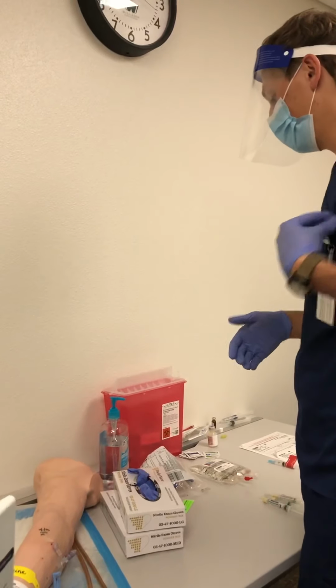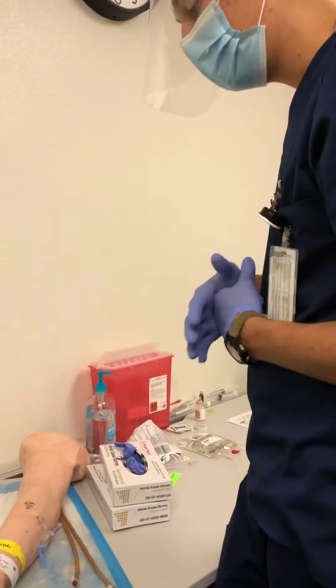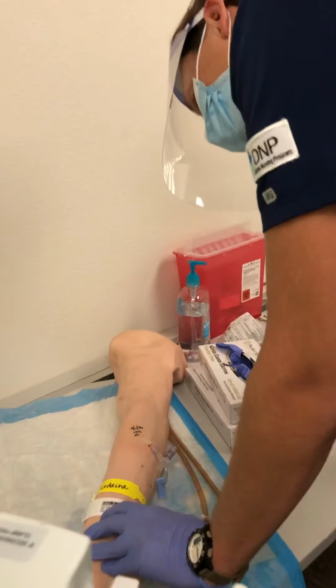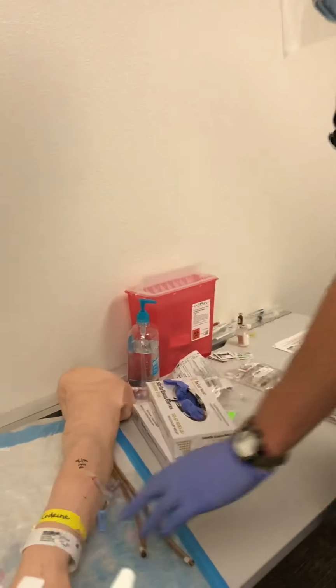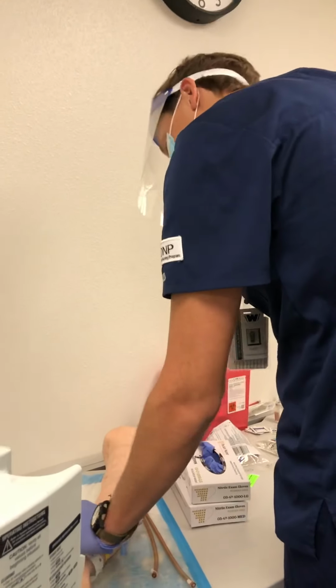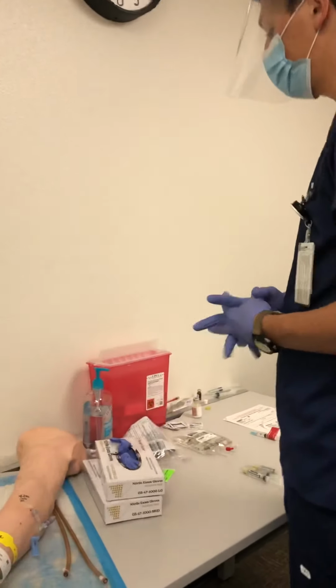introducing myself. Put on gloves after washing and just have them confirm their name and date of birth for me. So they told me their name and date of birth, Shirley Coast 4387, and that matches their wristband as well as my MAR here. They also told me that they are allergic to codeine, which is also what's on their wristband and on my MAR, so I know I'm in the right patient's room.